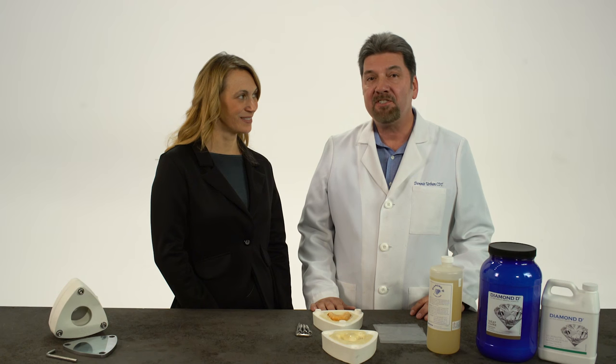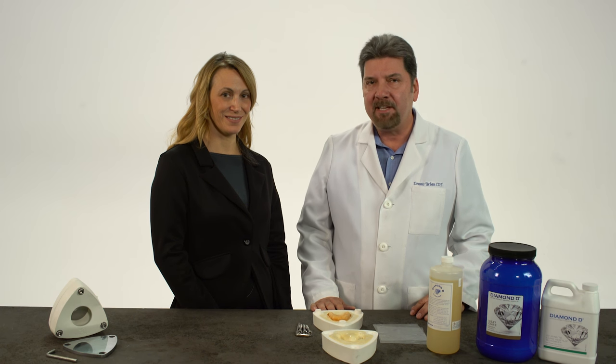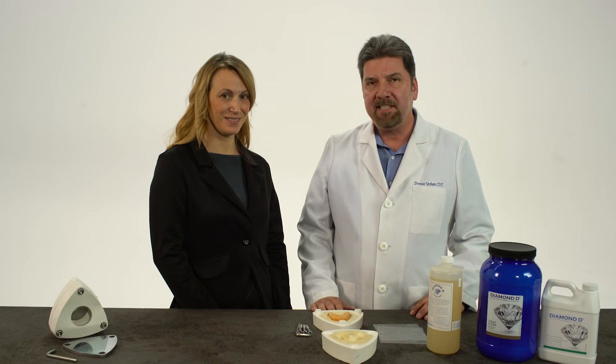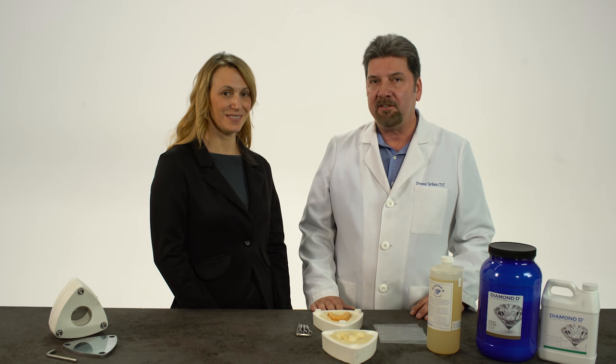Diamond D Denture Acrylic is one of the leaders in acrylic and dental technology around the world. Because of its natural look and high-impact strength, you can rest assured that with Diamond D Acrylic, you can achieve the same quality results time after time. For any type of denture case, whether it be a partial, a full denture, or an implant-retained denture, the unsurpassed aesthetics, fit, and strength and bond to denture teeth is something that technicians around the world have accepted as a quality standard on removals.